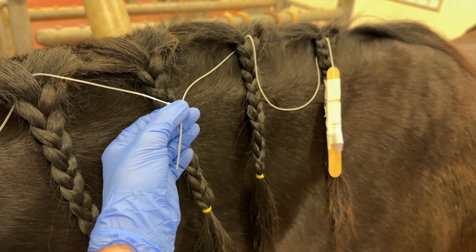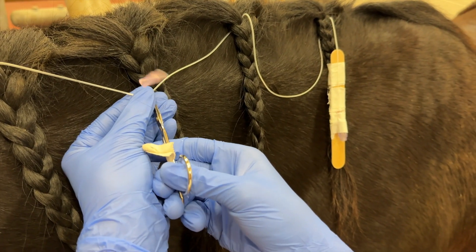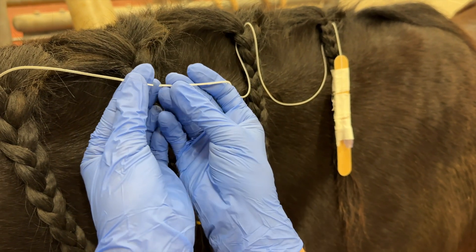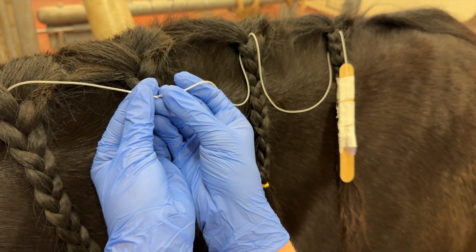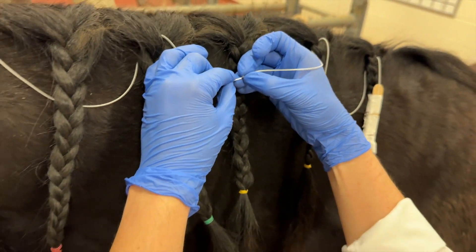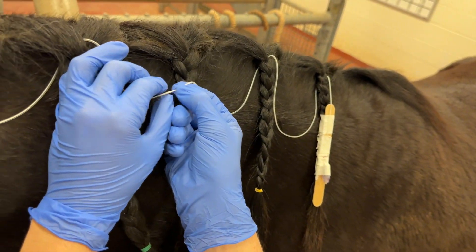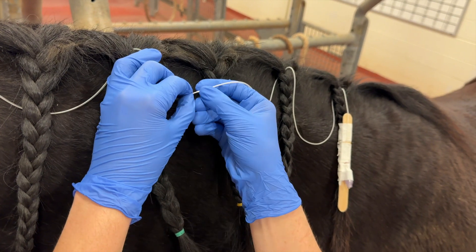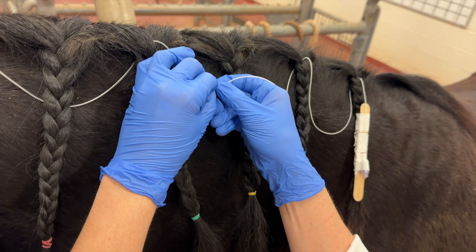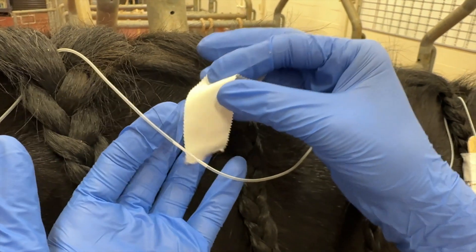Cut off the hub in order to then have another free surface to splice on the other tubing side. This is probably the hardest part because it does require you to place this small tubing on top of the catheter, and when you do that you don't really have anything to push against. Try not to bend or kink the catheter when you do this — this will require some patience — but once you have it in place enough that it is seated onto the catheter, you can tape it in place.